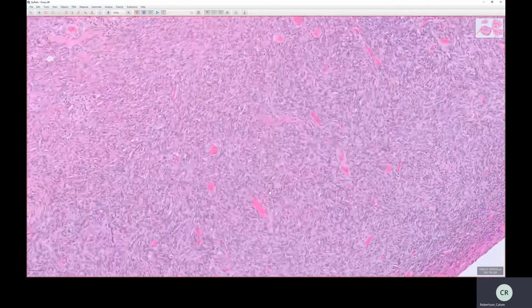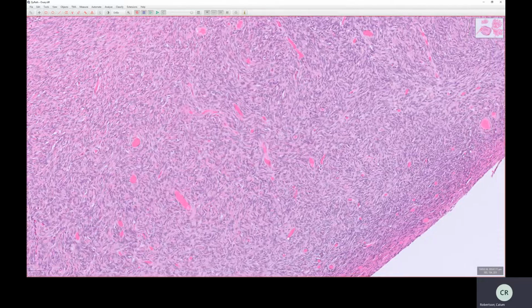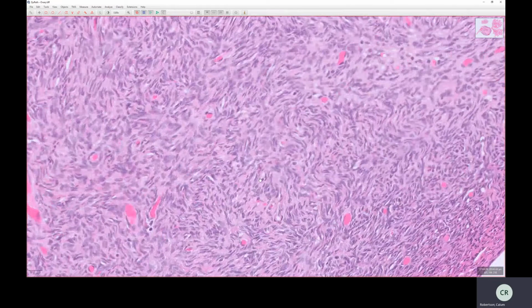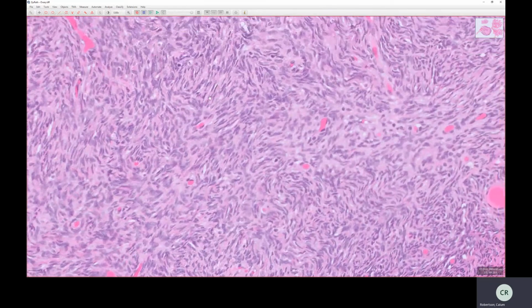So it's very blue, isn't it? That's because it's taking up a lot of hematoxylin pigment, and that is because most of the material we're seeing here is nuclear material. These cells don't have very much cytoplasm. These are the cells of the ovarian stroma, and they are spindle-shaped cells or fusiform-shaped cells. If we look at the nuclei, it's difficult to say where the cytoplasm ends and begins between the cells. So we'll look at the nuclei.